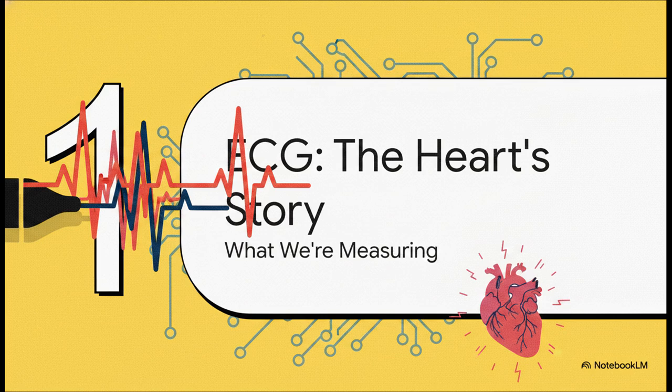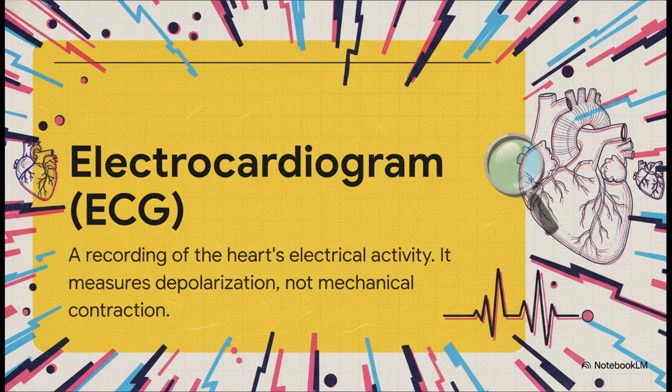So before you can read any story, you've got to understand the language it's written in. What is that pen, that little stylus, actually drawing? What are we measuring here? And here is the absolute key point. An ECG is all about electricity.